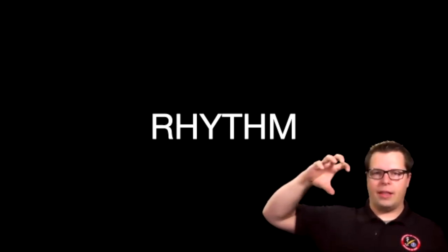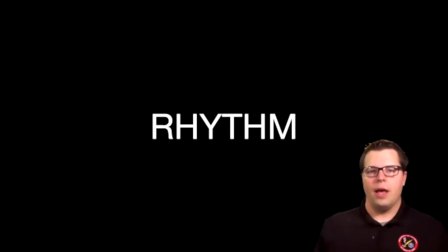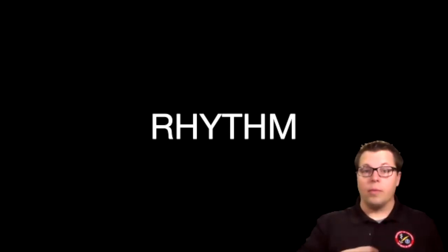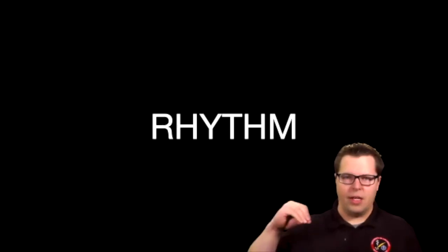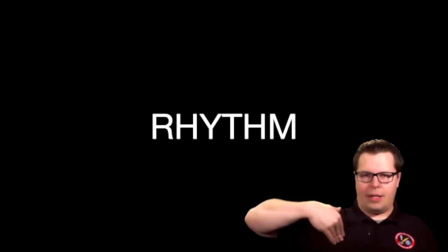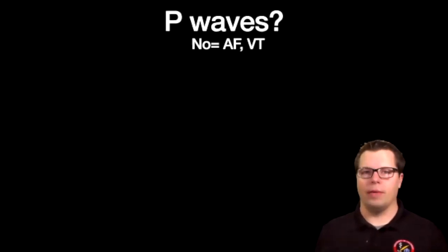So when we say sinus rhythm, it means it starts at the sinus node, the SA node, this guy up in the upper top of the chest. There are other rhythms and other places where you can get electrical impulses from. Sometimes it comes from the AV node. Sometimes it comes from the ventricles. Sometimes it comes from the atria. Either one is possible, and you can get a non-sinus rhythm. Sinus rhythm specifically refers to beats coming from the SA node at the top that propagate down through the rest of the heart, generating P waves, essentially.